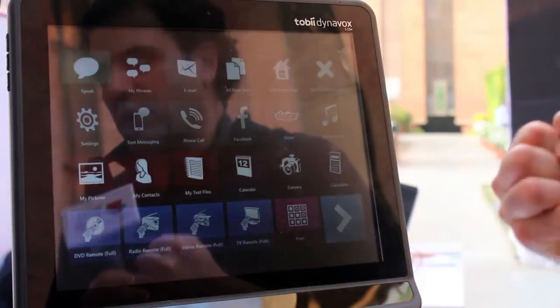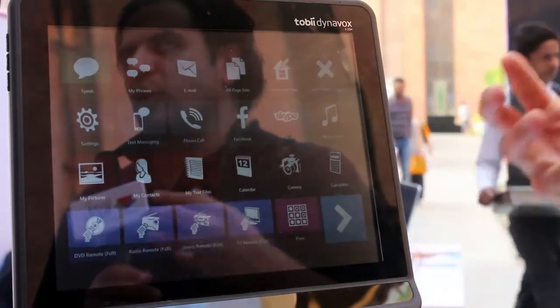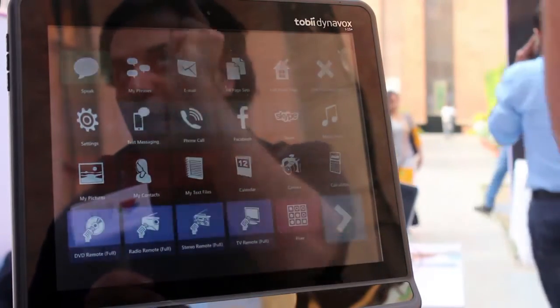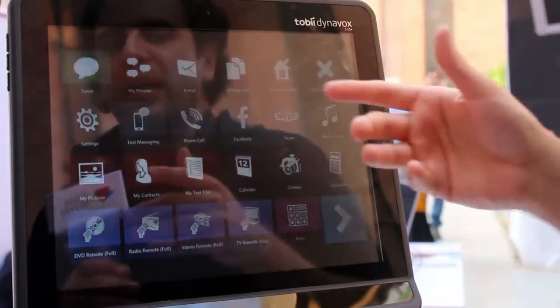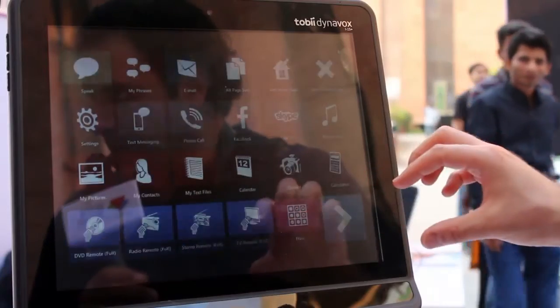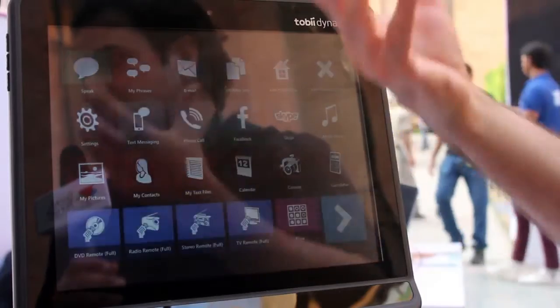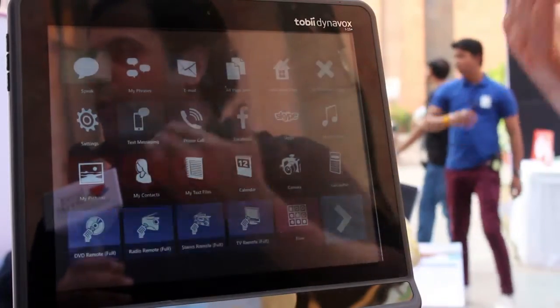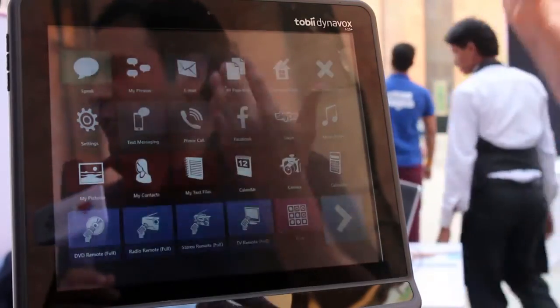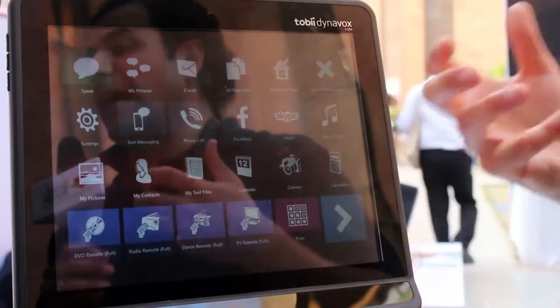So, as I mentioned, the range is anything from really small babies who are born with a disability and the parents really want to find ways for them. When normal children point at things, we give them labels. We teach them words. They point at something and we tell them what that object is. The same way with children with disabilities, you can start with those simple games that I showed you to teach them how to point with their eyes. Eventually they will start to use symbols to express more and more complex needs, and hopefully we can also get them to literacy. And on the other end of the spectrum, you have adults, people with injuries, disabilities that just want another tool to be independent, another tool to access computers.